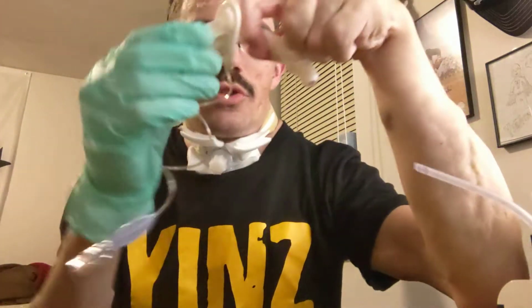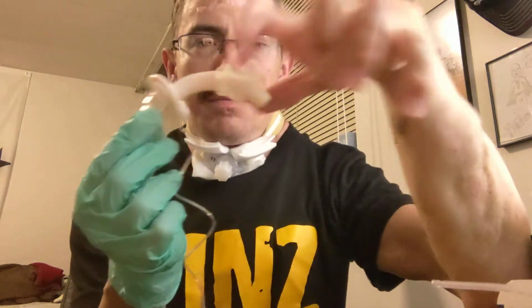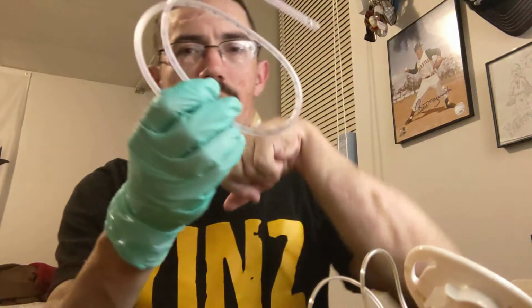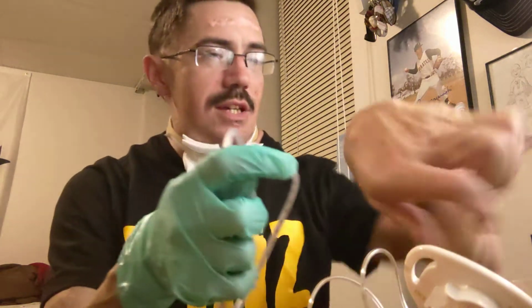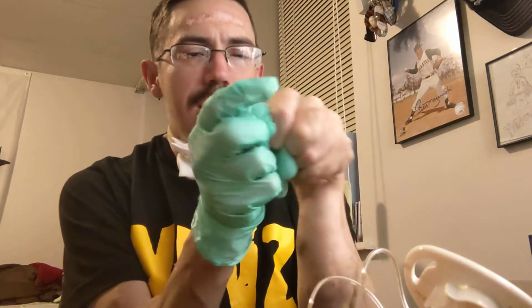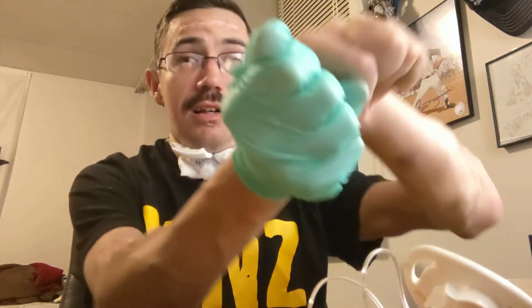But yeah, again, this is the trach, and you fill up that little balloon, and that keeps the airway from causing the air to come out of your mouth. And of course, showing you the proper disposal of these things. What I would end up doing is I would take my other glove too, and we'd put it together like this, just crunch it up, put the other glove in this hand, and then we would take this glove, go like this, and there we go, ready for the garbage. And then we would throw it in the garbage, and life would be pleasant.